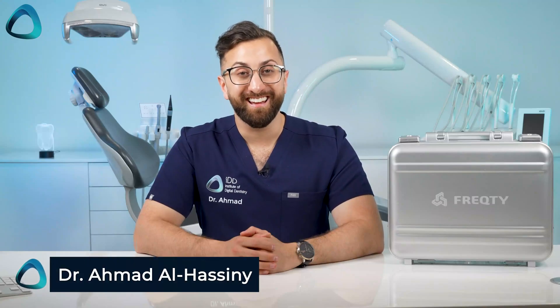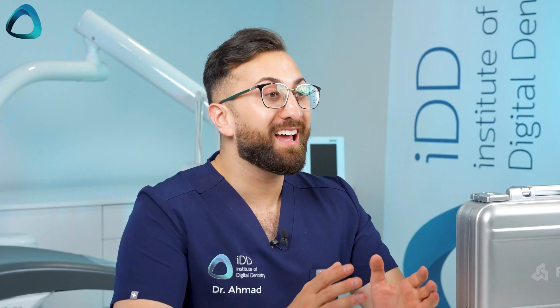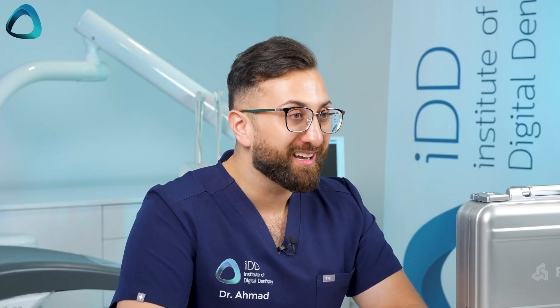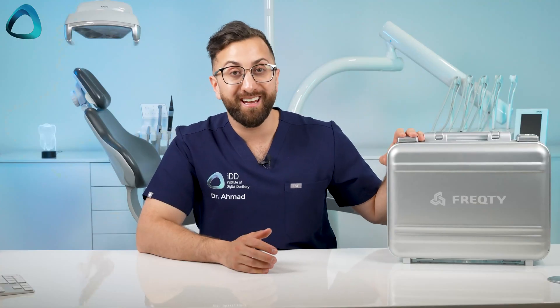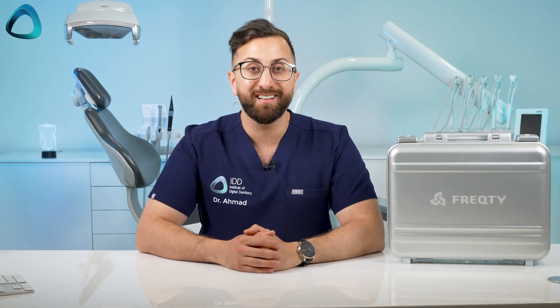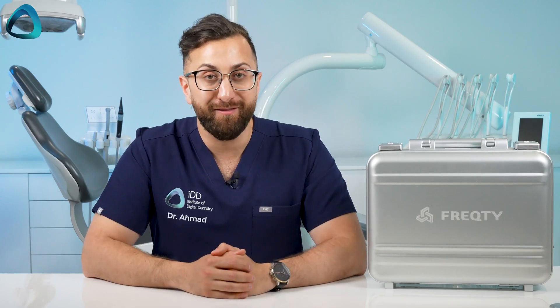Hey guys, Dr. Ahmad Al-Hassiny here and welcome to another intraoral scanner unboxing. We are at the end of 2023 and there have been a number of scanners arriving at IDD HQ, including this one right here, the PandaSmart intraoral scanner. This is a scanner I've been asked about a lot, so I'm super excited to finally have it here.